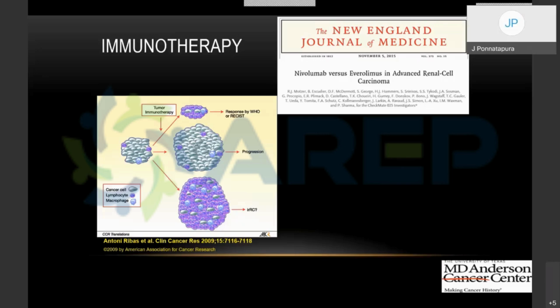Hi, Dr. Raghu. This is JP again. Thank you so much for the wonderful talk. Very educative. Thanks a lot. I had one question, but not regarding the solid renal masses. I need your opinion on the proposed modified Bosniak 2019 classification. We always used to use the old Bosniak, which was initially done for ultrasound, but this one is for more cross-section with CT and MR. So what are your thoughts about that?